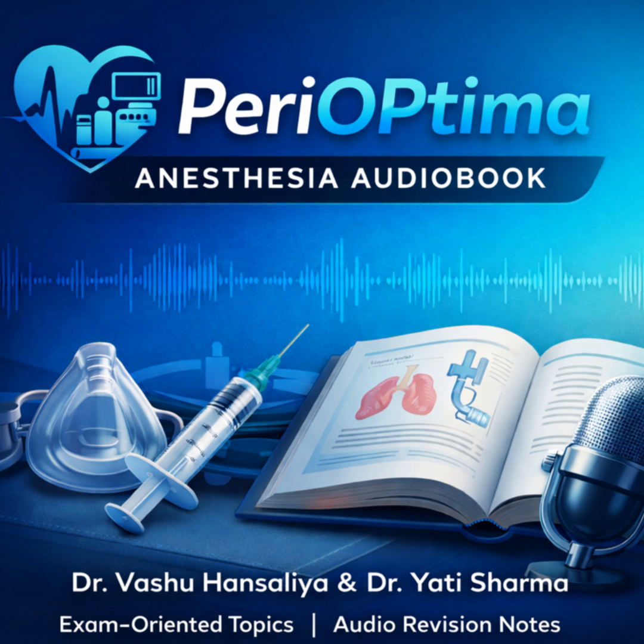We need this balloon to inflate and deflate extremely rapidly, in milliseconds, to match heart rates of 100, 110, 120 beats per minute. It has to keep up. A low-density gas creates laminar flow through that long, narrow catheter tubing. If you used air, which is heavier, the flow would be turbulent, the resistance would be high, and the balloon would be sluggish. It wouldn't catch the dicrotic notch in time.